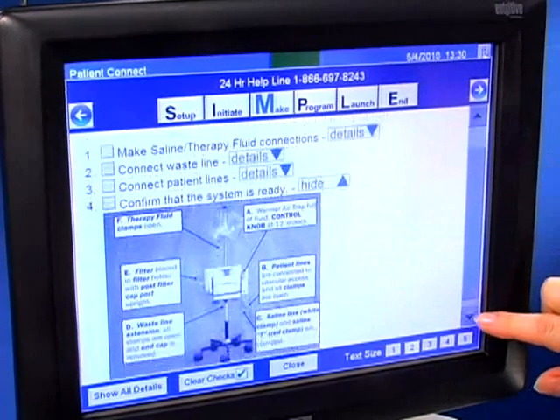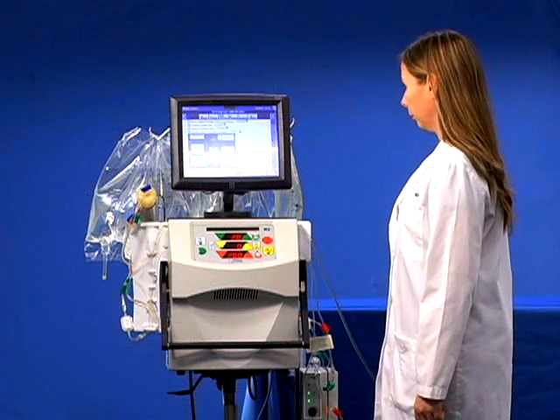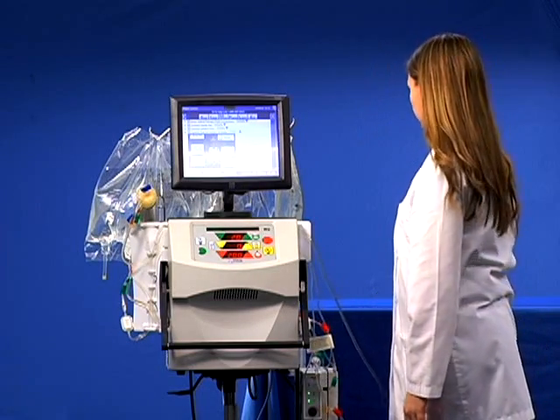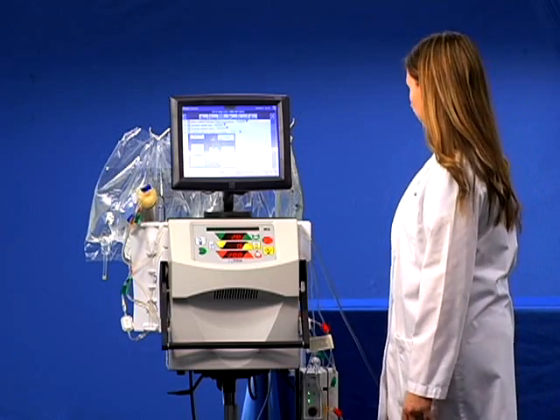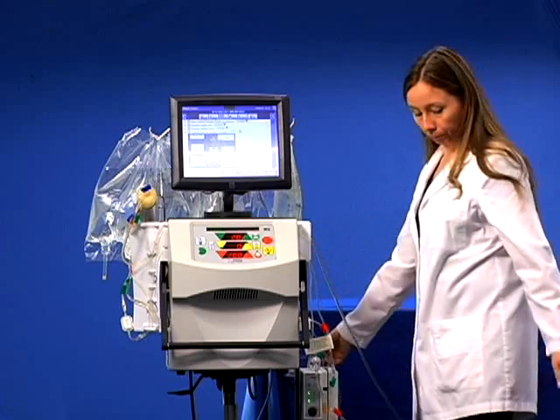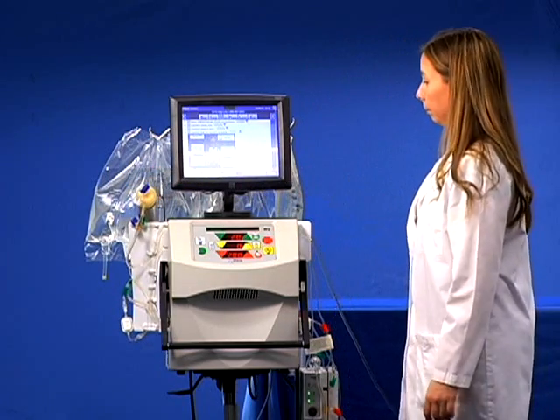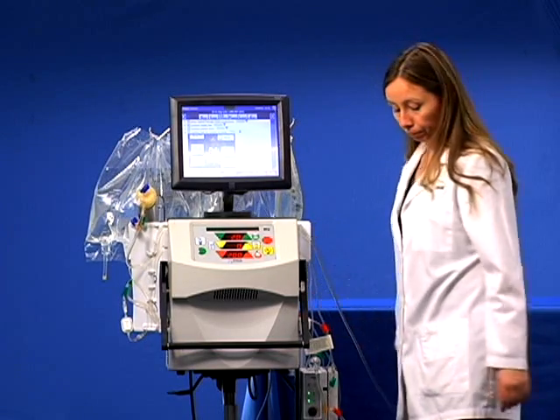Click on the details button on step number 4 to confirm that the system is ready. Completion of these steps may prevent inadvertent alarms. Check the optional fluid warmer and make sure that the air trap is full of fluid and the control knob is at 12 o'clock. Look at the patient lines to see if they are connected to the vascular access and all clamps are open. Check that the saline line and the saline T are clamped. Check the waistline to see that all clamps are open and the end cap is removed. Make sure that the filter is in the filter holder with the post filter port upright. Check that the therapy fluid clamps on the lines being used are open. This completes the make cartridge connections section.